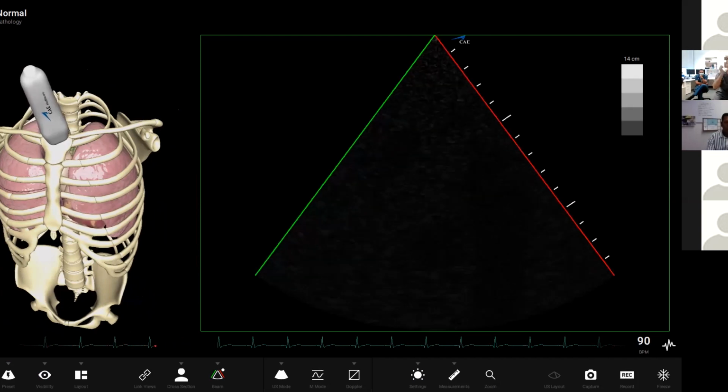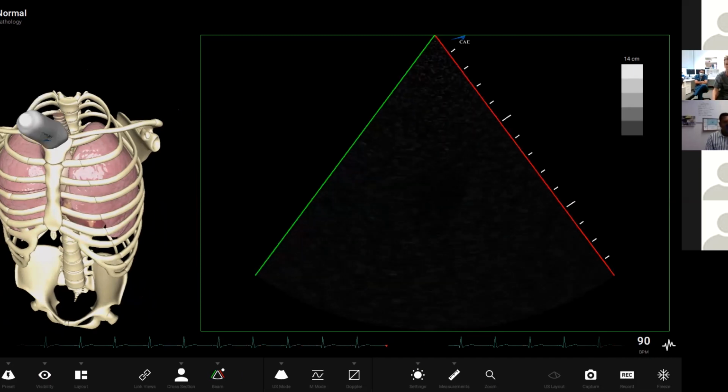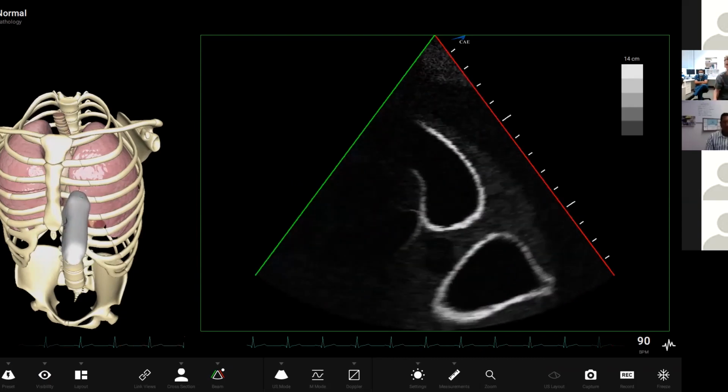I think it lacks. It's a bit like trying to rule out PE with a transthoracic. I think you can say that it's there if you see it in the ascending aorta. If you can't see it, you need a TOE to try and exclude it. And that's again the clinical situation. Kylie, it must be hard trying to decide if you're going to lyse someone or not and exclude aortic arch dissection with transthoracic. But that's sort of the best I've got with transthoracic.